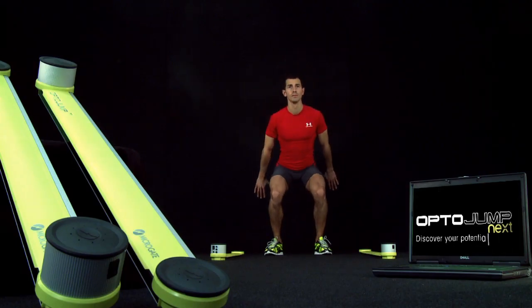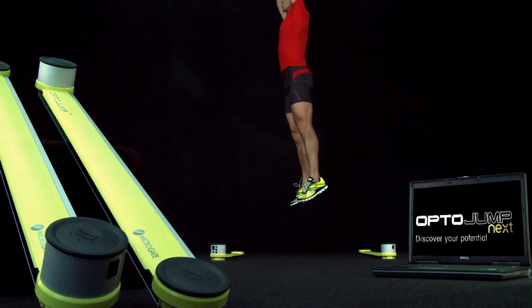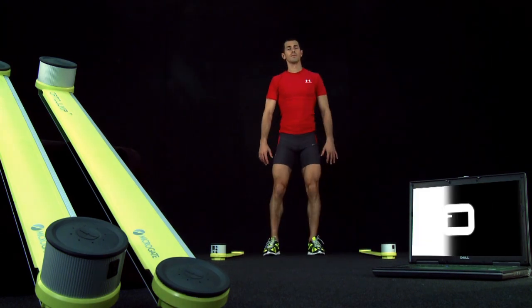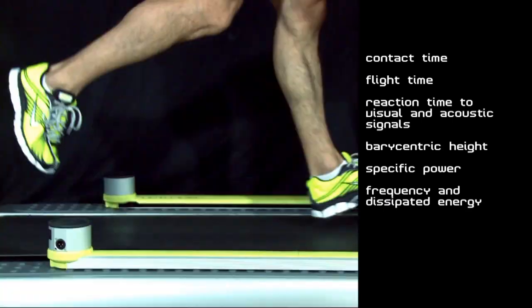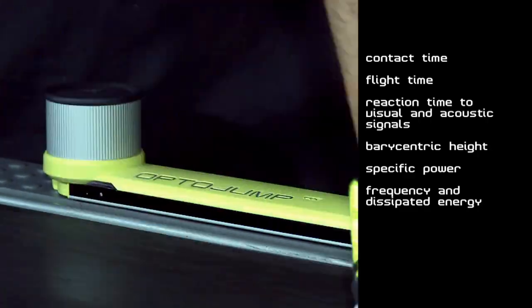In the single-meter configuration, OptoJump Next allows users to perform jump, reaction, and running tests. When mounted on a treadmill, this configuration can measure contact time, flight time, reaction time to visual and acoustic signals, barycentric height, specific power, frequency, and dissipated energy.